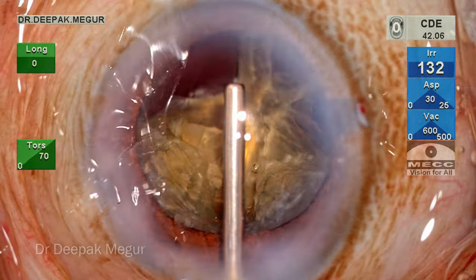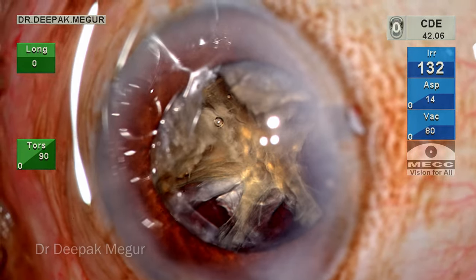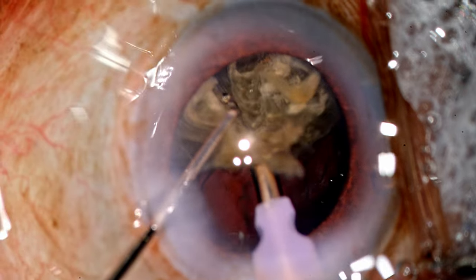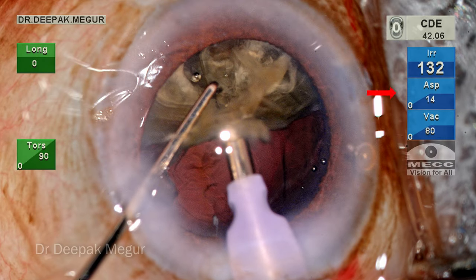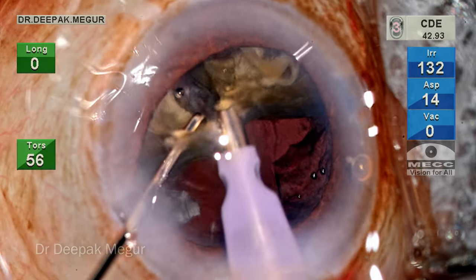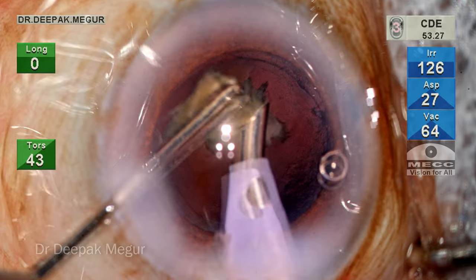Time to refill the OVD again. We can see the posterior plate pedicles which have been cut off from the removed fragments. Now to deal with the attachment of the last two fragments. With half of the bag empty, this is an ideal situation to use my technique of phacoing the base — just lift up the fragments so that the posterior plate comes more anterior and we are far away from the posterior capsule. Nudging the top part of the nucleus brings the posterior plate toward the anterior aspect so we have access to phaco the attachment. The setting is changed to Sculpt mode, which has very low flow rate and vacuum, so we're unlikely to damage anything. Using Sculpt mode, I emulsify this bridge holding the two pieces together. These two pieces are now free and easier to consume individually using direct torsional energy. The last fragment is then emulsified.